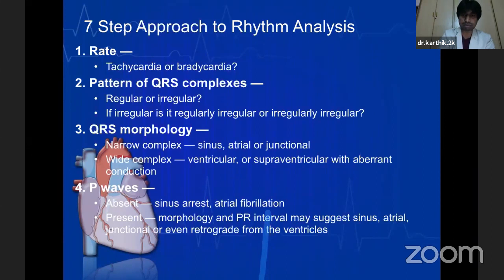So we'll be discussing in detail about the QRS complex in the next few slides, but here you need to know the pattern of the QRS complexes, whether the QRS complexes are happening at regular intervals or they are occurring at irregular intervals, whether the RR variation is regular or irregular. If it is irregular, is it happening at regularly irregular intervals, or is it irregularly irregular? That means the extra event, whatever is happening, whether it is with tachyarrhythmia or bradyarrhythmia, is it happening at recurrent intervals after a few fixed beats, or is it happening at random events?